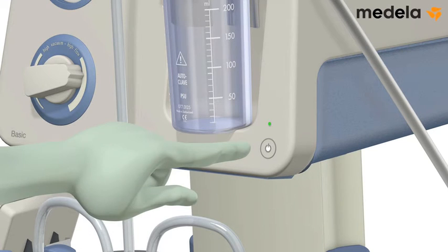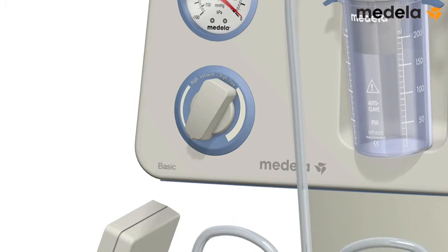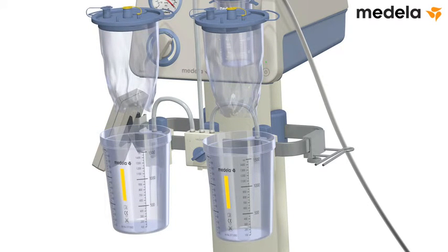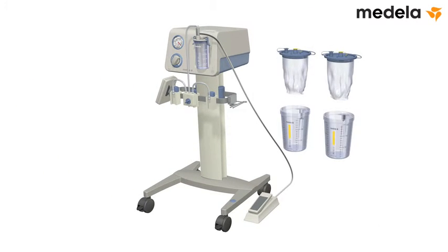Turn the pump off. Turn the vacuum regulator fully counterclockwise to set the vacuum level to zero. Remove the disposable liners and discard them in accordance with hospital policy. To save time for the next procedure, insert new disposable liners into clean jars.